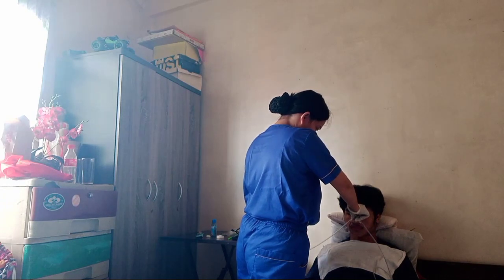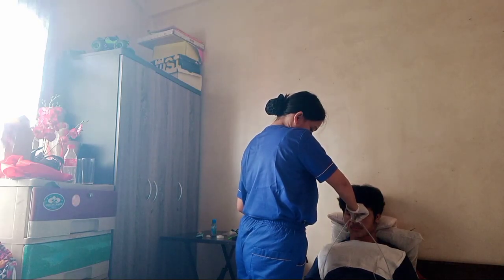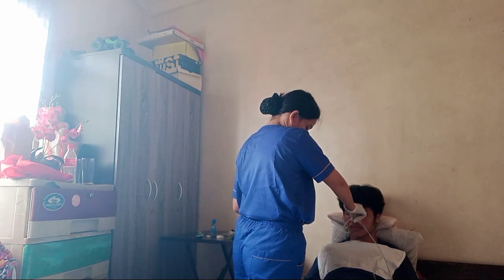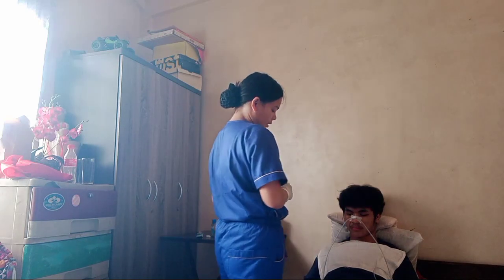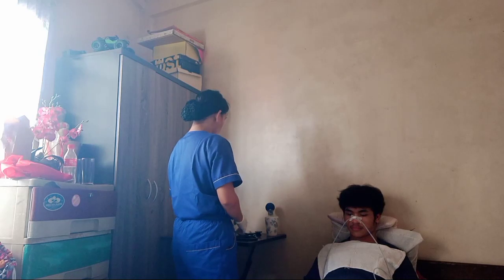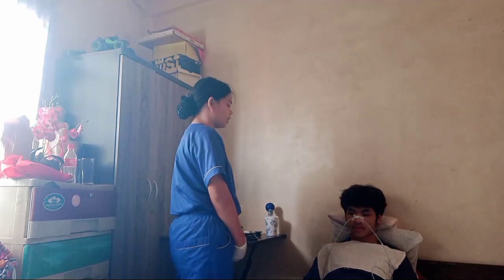Then, after that, fasten the tube loosely to the client's gown with a safety pin. Then, assist the patient to a comfortable position and administer oral hygiene and clean the tubing and nostril. Then, after that, remove the gloves and wash hands and record the procedure.